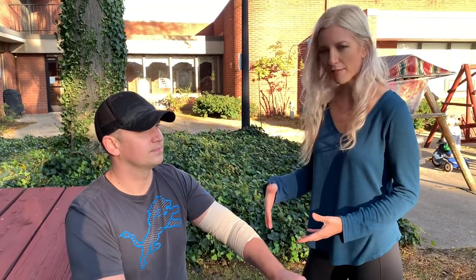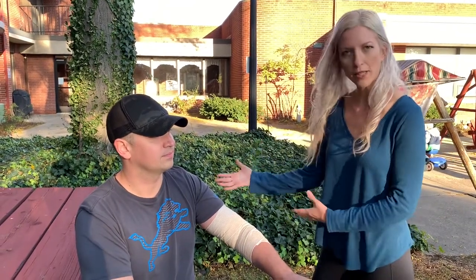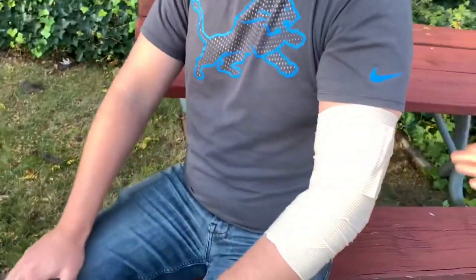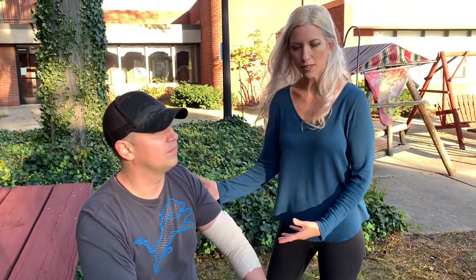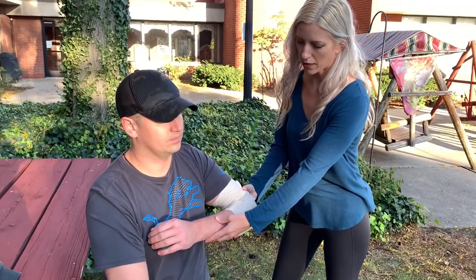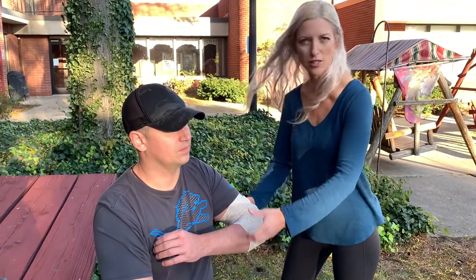If you are having any of those symptoms, you want to take the wrap off and rewrap it more loosely. So that's a quick demonstration on how to apply an elastic bandage to the elbow. You can also use the elastic bandage with a sling — you just want to bring the arm up to the level of the heart and secure the elbow in that position if the patient is able to bend it.